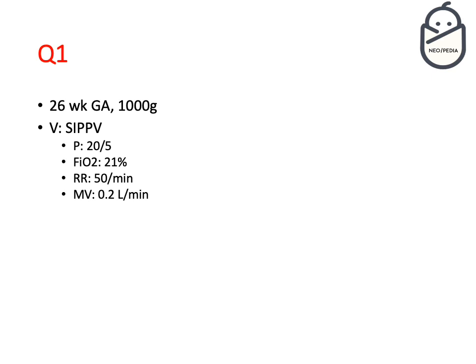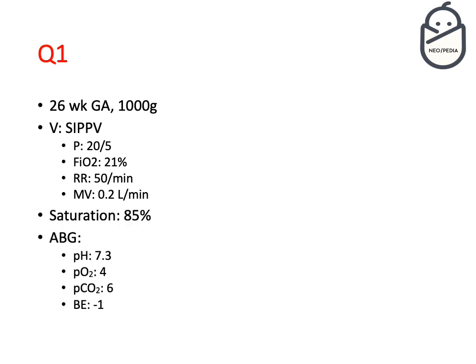So basically this gas is in kilopascal. So you can multiply it, I think, by 7.5, so you can get the number in millimeter mercury. So what do you think the problem is in this condition?